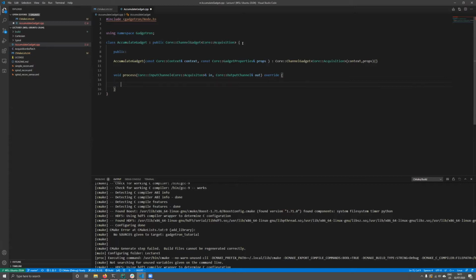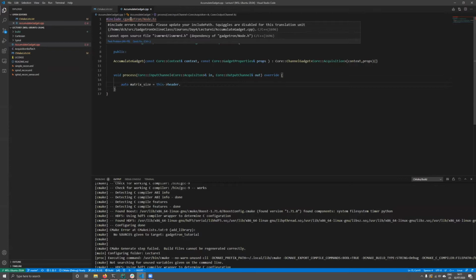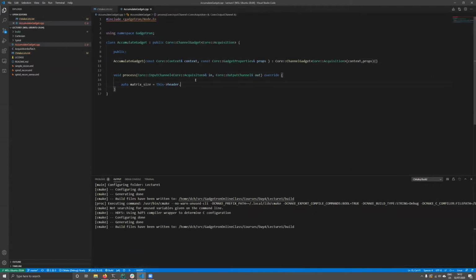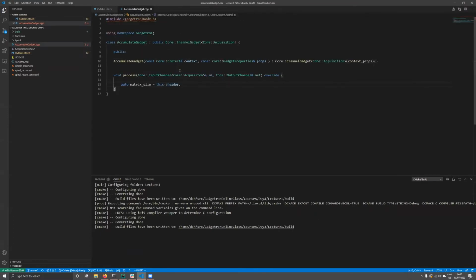So what we're trying to do here is set up a k-space buffer and fill it with acquisitions. And once the buffer is full, we send it on to the next gadget. So first order of business is, how big is the buffer supposed to be? So we have a header property. Why are we complaining? Okay. We have a header property.